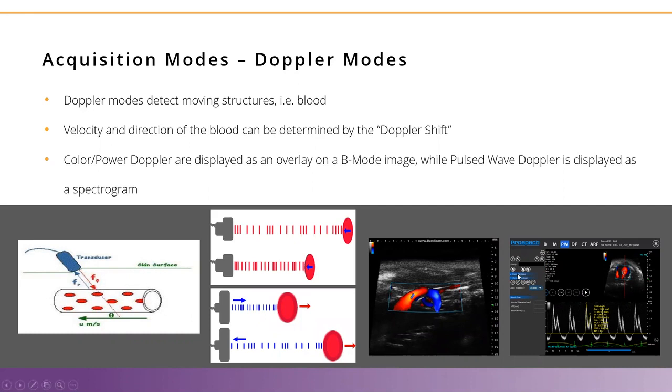We can use these then to take a look at the flow through the heart, and we'll look a little bit more detail into this, but basically on this scout window that we saw previously, we're going to have a color Doppler image. That's the last one as we switched into pulse wave Doppler. And we're going to place a sample volume within the jet that we're looking for.